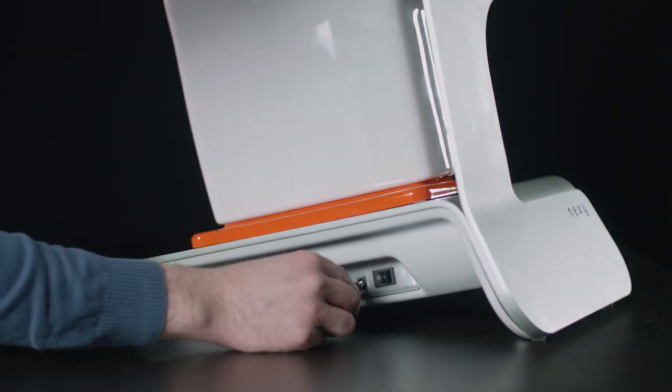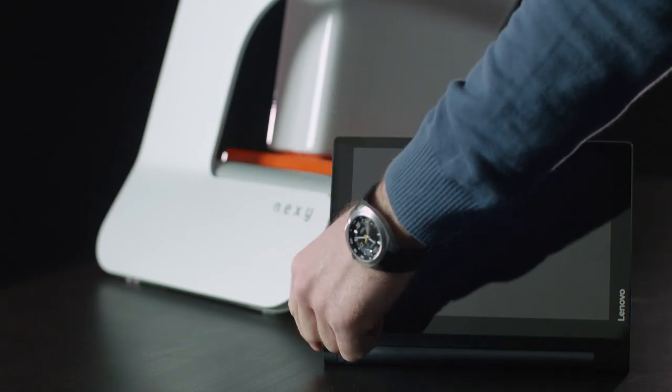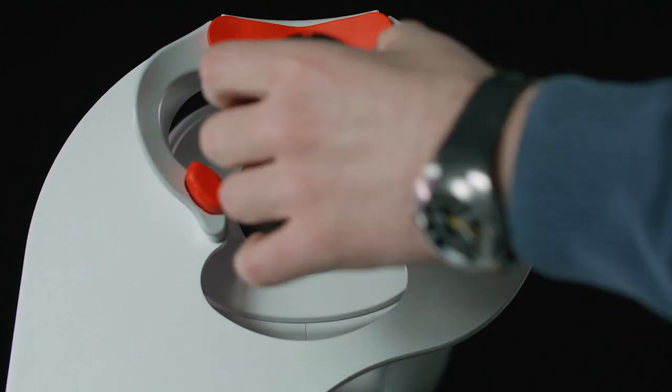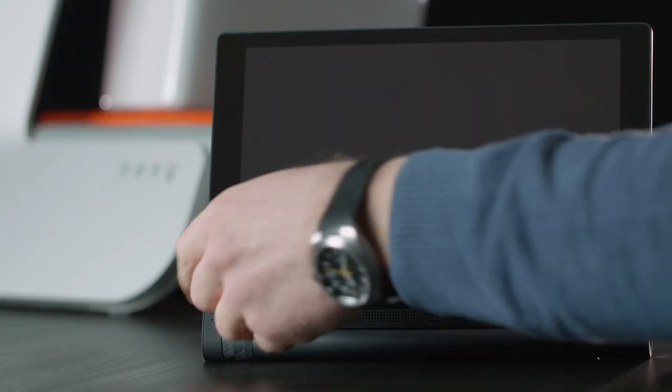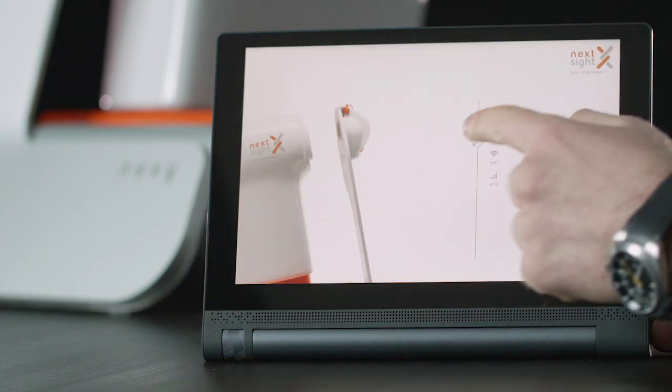Using Nexi is remarkably straightforward. Just plug the camera into the mains and switch on your tablet. There are no cables or other devices that need to be connected or plugged into a power source. Once Nexi and the tablet are up and running, just click on the Nexi app and get to work.